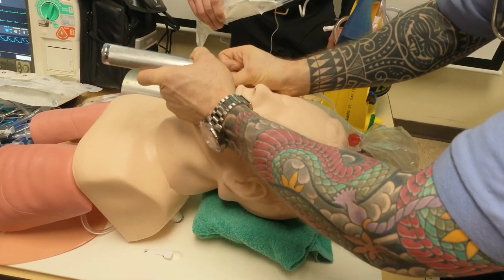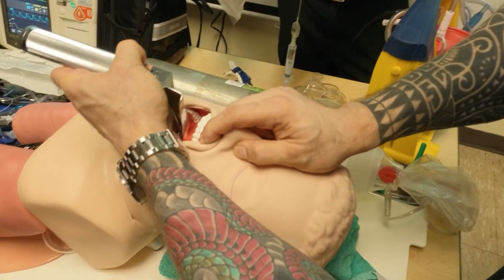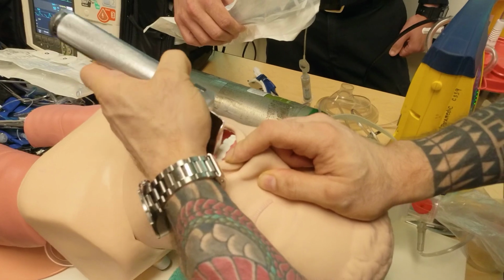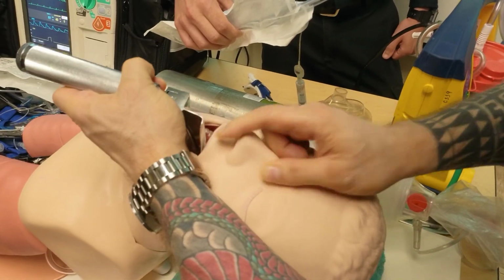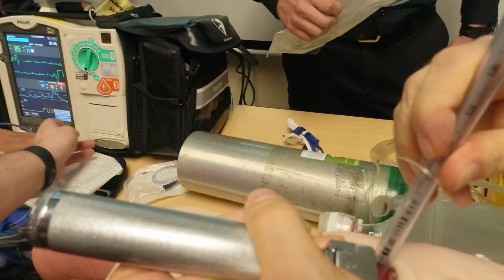Once I slide my blade into the vallecular space, you see how I'm not on the teeth? See how my motion is rock'em sock'em robot style? You see that? I'm not on the upper teeth. Breathe for me, sir. I take my tube. If it was an 8.0, how far down do I want to go?